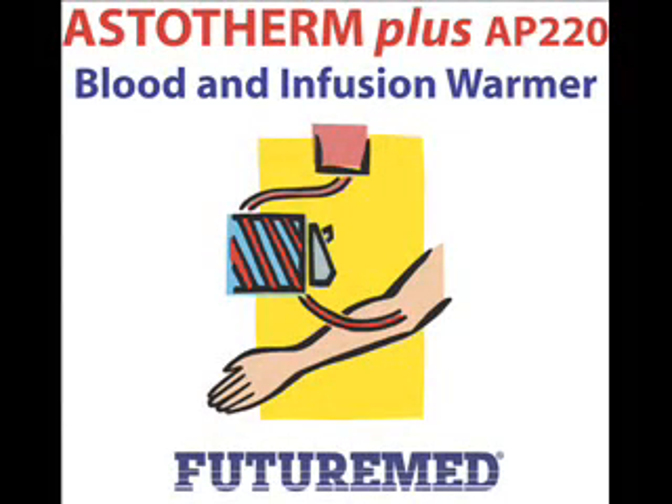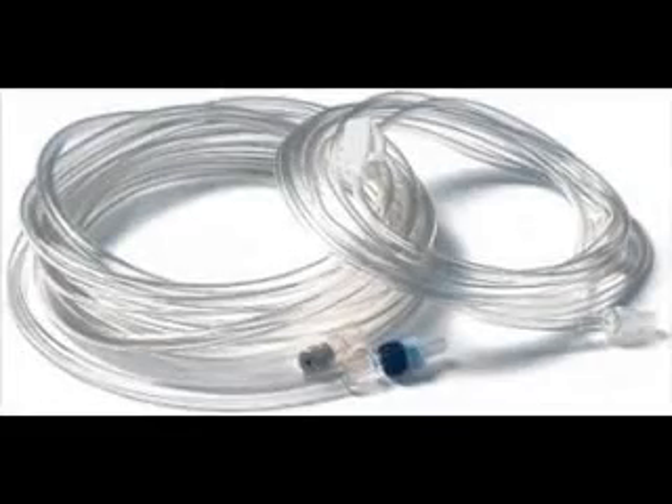The Astotherm Plus Blood and Infusion Warmer allows you to save money in a few seconds by using inexpensive disposables. And that applies again and again with very little effort being involved.